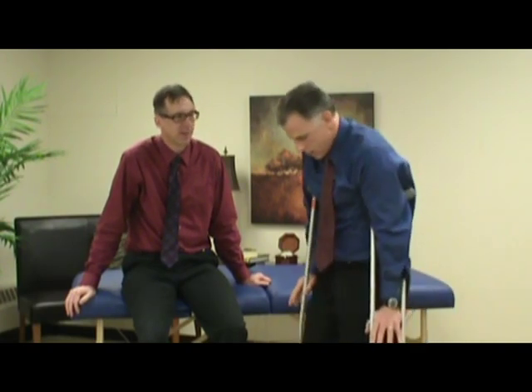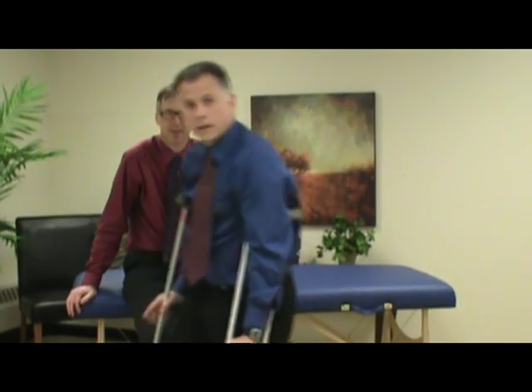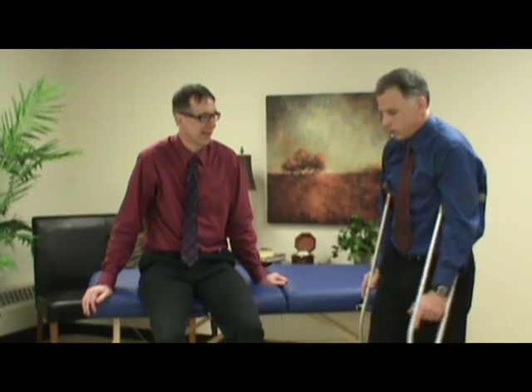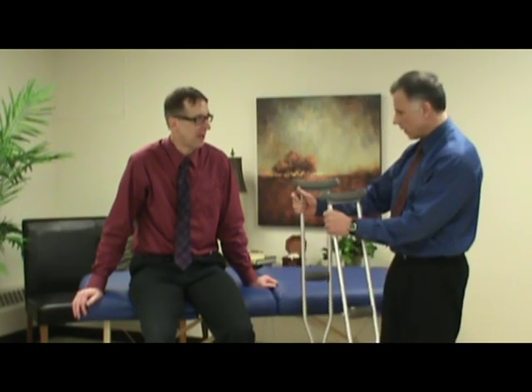All right. So then, you can simply work here, and it works real nicely. Forwards, backwards. Now, you'll get teenagers, and they'll start walking. I don't recommend it, but they'll try walking without the crutches. They get pretty good at it too. Is there anything else, Bob? I think that's it, Brad.